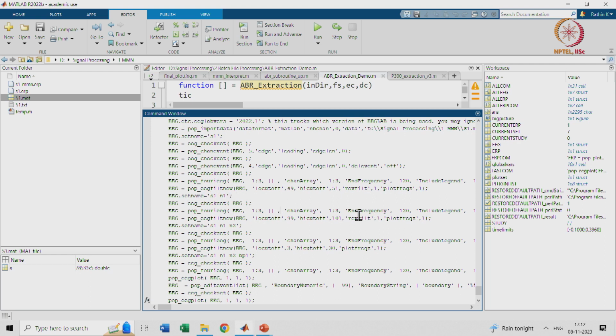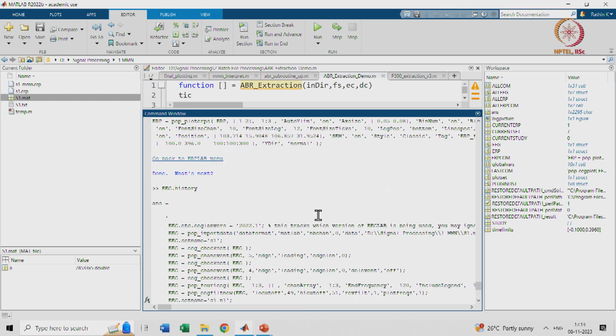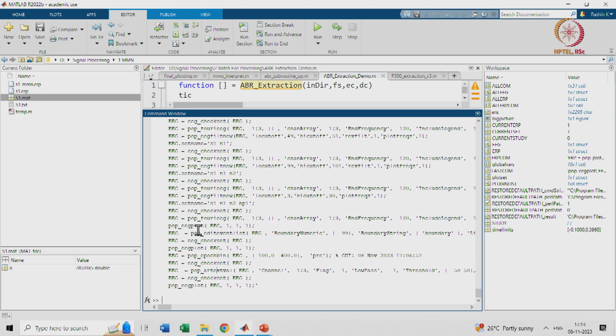Further, we did the same thing again for the power line multiples of 100 Hz. To remove that, we performed a band stop filter and named it S1N1N2. Then we performed a band pass filter. Here you don't see reverse filter 1 because the default value is 0, and you gave it 3 to 30 and named it again. Furthermore, you edited the event list, gave the names, generated epochs, performed artifact rejection, and then plotted the results. So whatever you do is mapped in terms of one command line.